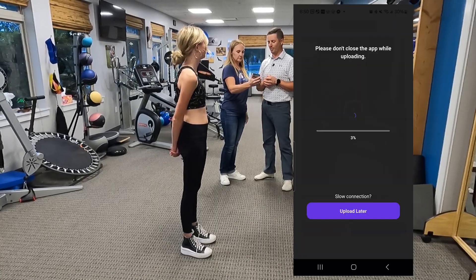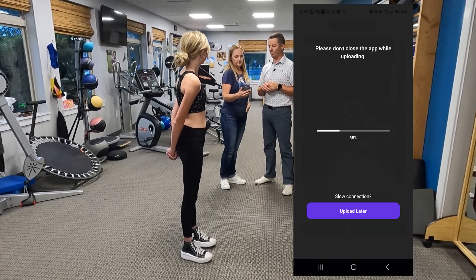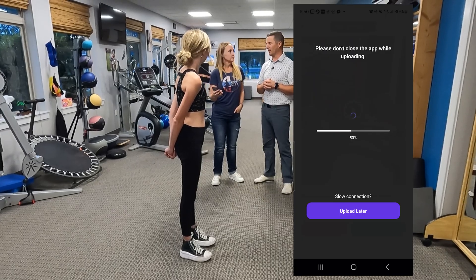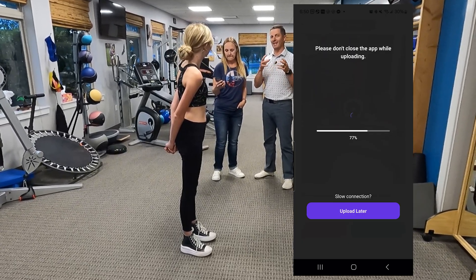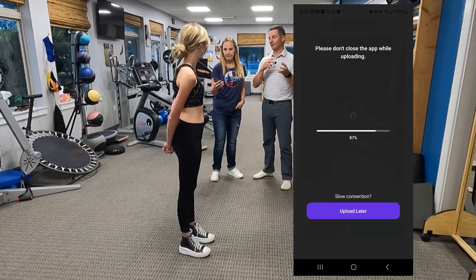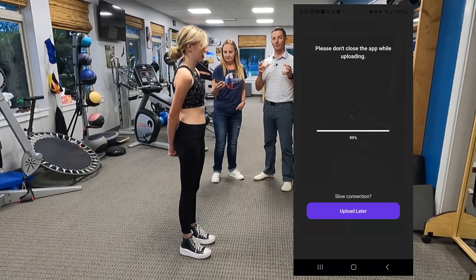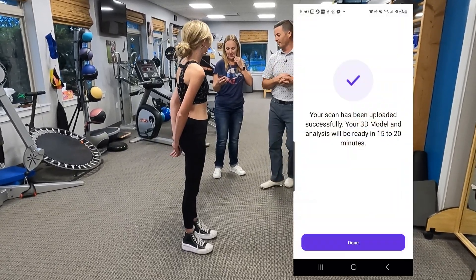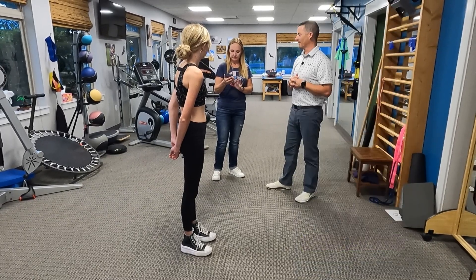You can approve and upload, and then it uploads to the cloud, goes to Momentum Spine, and they put it in their AI software which estimates what size the curve is. Overall a good scan and a good process.